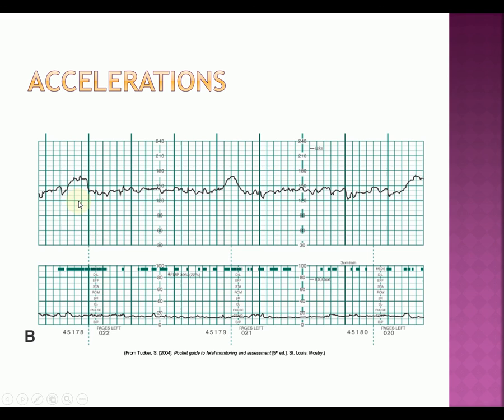So if you look at your strip, your baseline is running what? We've got about 140 right there. We go over here, it looks like you've got about another 2 minutes there. So we'd probably call that baseline 140. With baseline 140, we've got 10, 20, 10, 20, 10, 20 that's lasting for how long? 10, 20, 30 seconds.